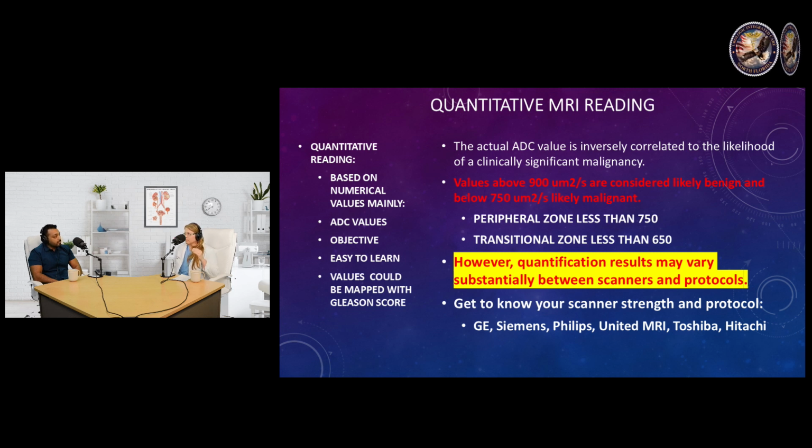I find it very helpful because sometimes you get MRI readings, perhaps they say PI-RADS 3, and we had a few of those, and we're like, okay, what are the numbers? Then we're able to pinpoint the numbers, and I see that there is something in the anterior area that they didn't even consider. That is ADC values of 300. It's very interesting, because it allows the plain urologist like me to say, oh, okay, well, look at that.